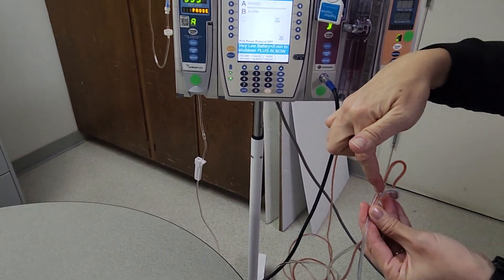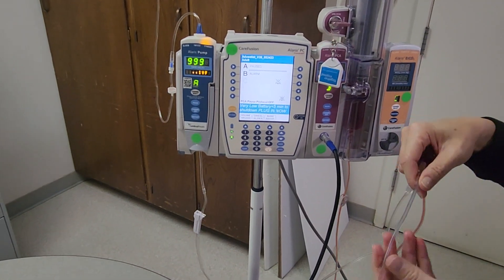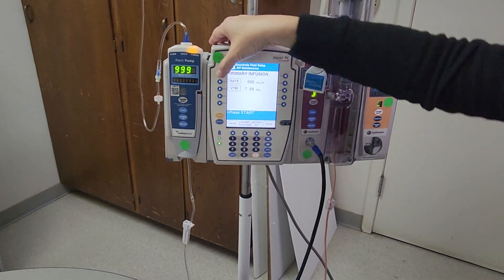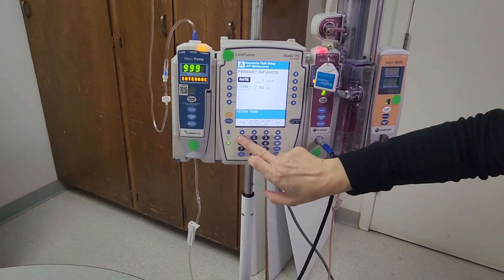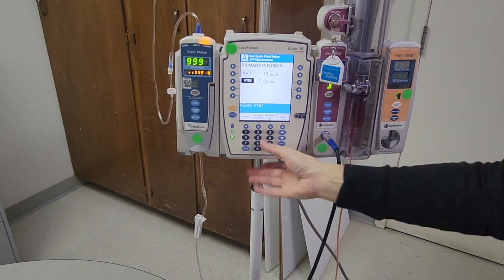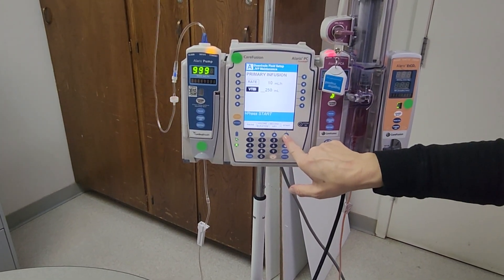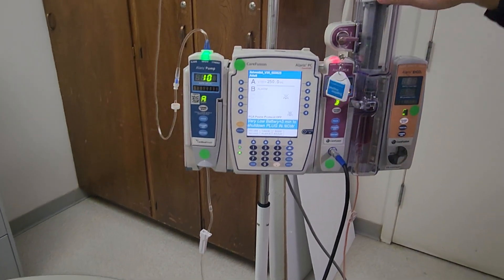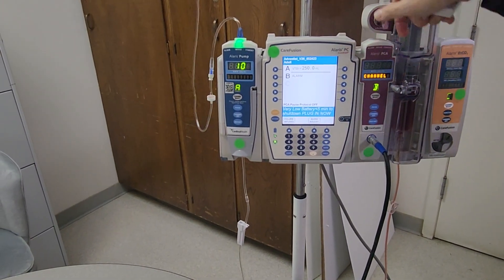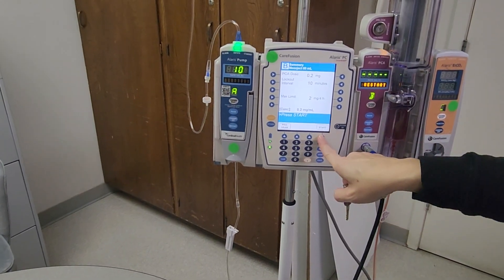We're ready to get this connected to the patient. Once tubing is primed, adjust your carrier fluid to the rate on your orders — it will be a low TKO-type rate; in this case, orders are for 10 mLs per hour. Set a volume that will last a while and start. Then go back to the PCA on channel B, confirm all the settings with your second nurse, and hit start.